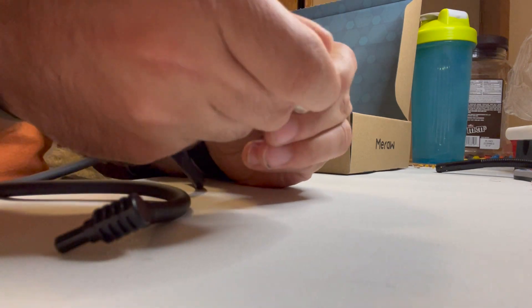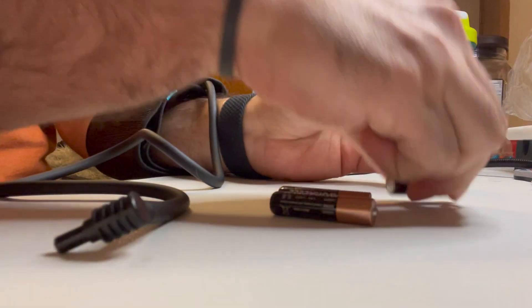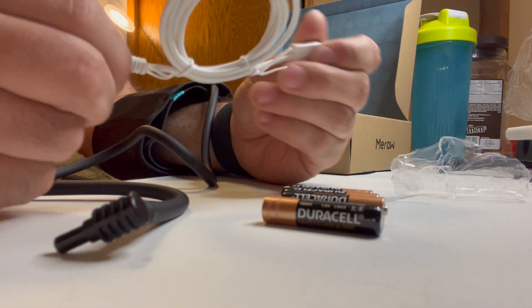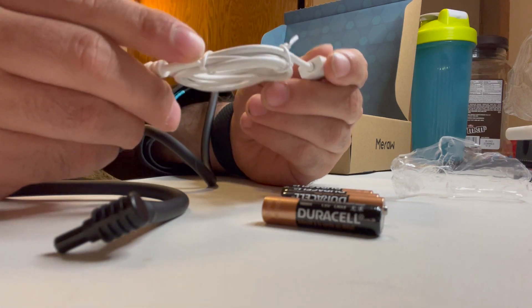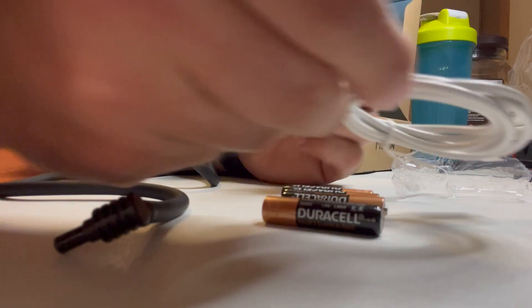What's really nice is it does come with some batteries. We can open those up as well. And then it comes with a USB cable right here — actually, that's just a USB, not a USB-C.